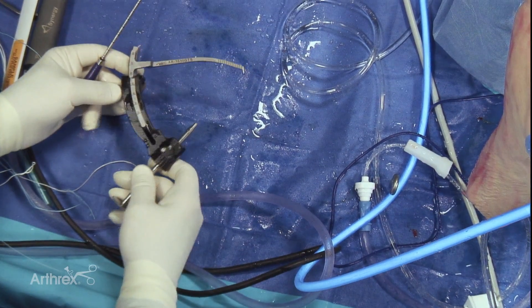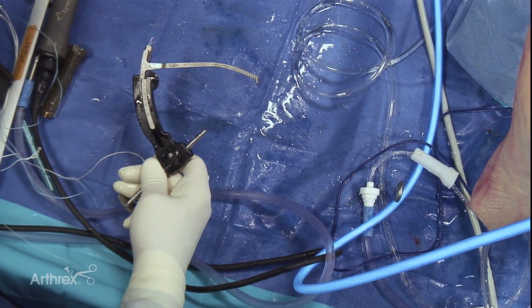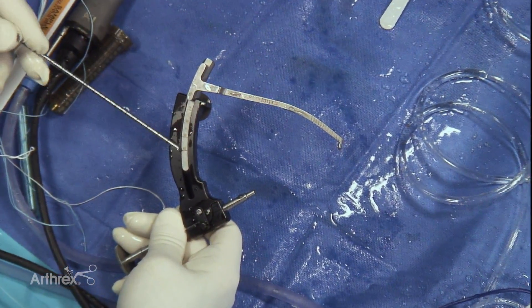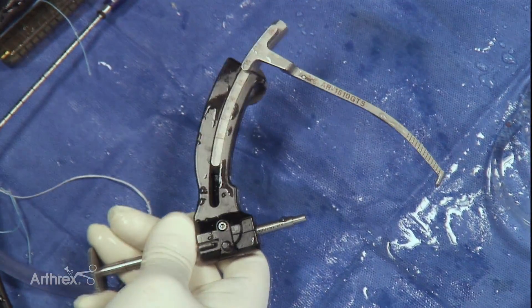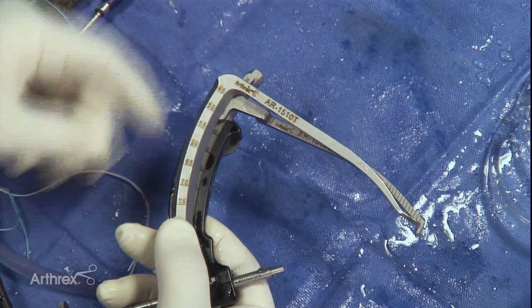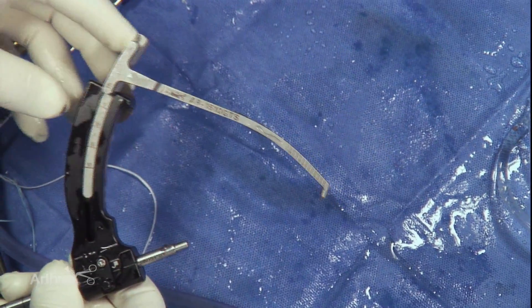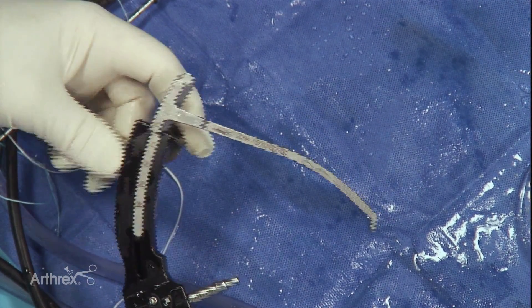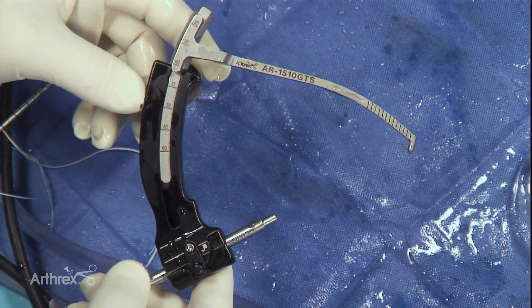This is our tibial guide for the pediatric age group. As you can see here, the measurements are a bit different than in the adult — they run from 30 to 60. And I think we have an adult guide here just to compare it to; the measurements on the adult guide are in the range of 45 to 75. The advantage to going a little smaller in terms of this number is that you'll be more horizontal and you'll be able to make more of an all-epiphyseal trajectory and avoid the proximal tibial physis.